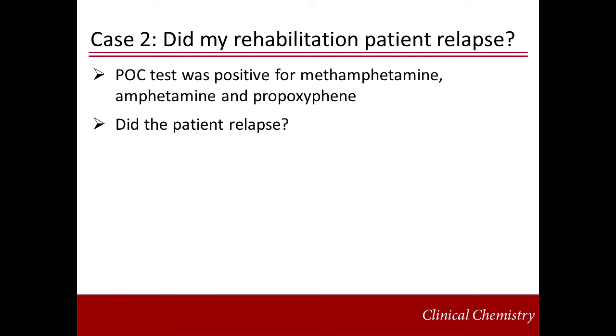For definitive detection of drugs in the specimen, a confirmation assay, such as mass spectrometry, should be utilized. Since both false positive and false negative results may be seen, these tests should not be used as background for sanctions such as exclusion from school, job dismissal, or loss of parental rights. However, since this screen was for counseling purposes, these results can be used for the therapist to guide her counseling.